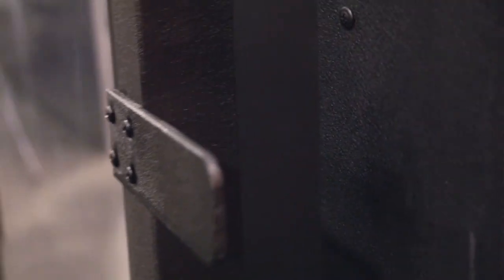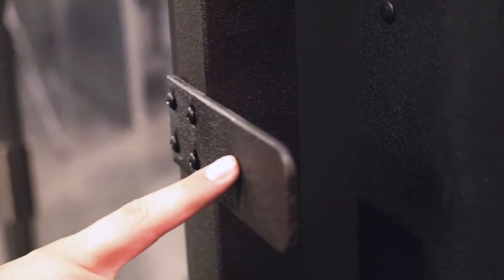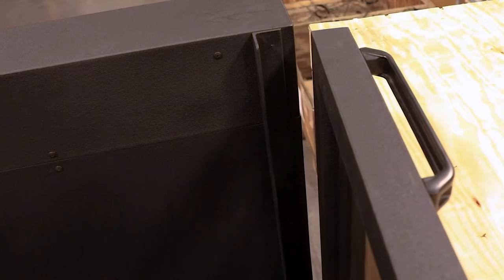The Protégé upper platform gate has magnetic switches mounted behind the sheet metal skin that must sense the steel strike on the gate for the lift to think that the gate is closed. This gate does not lock.